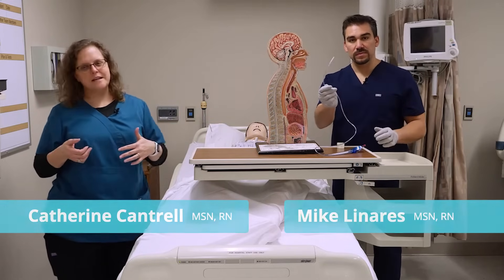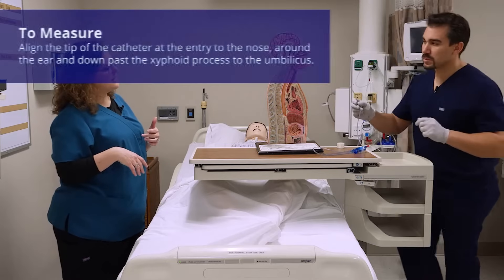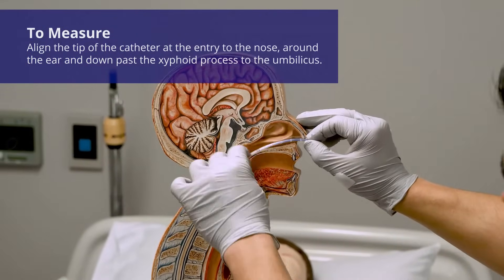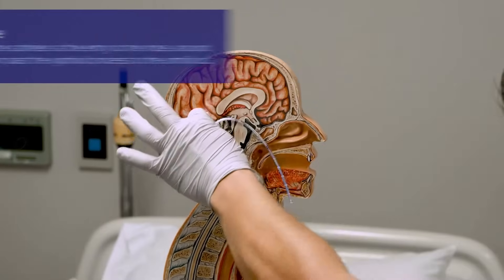First we're going to go through some basic anatomy so that you can see what you're doing. Mike's going to measure from the tip of the nose, around the ear, past the xiphoid process, and toward the umbilicus.